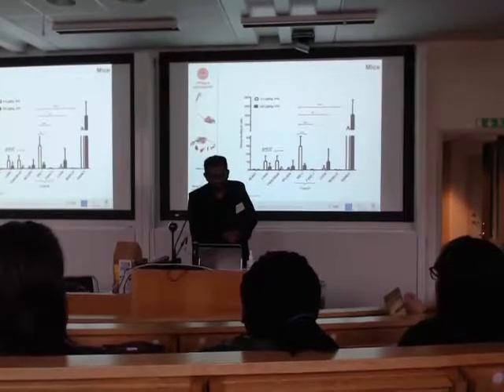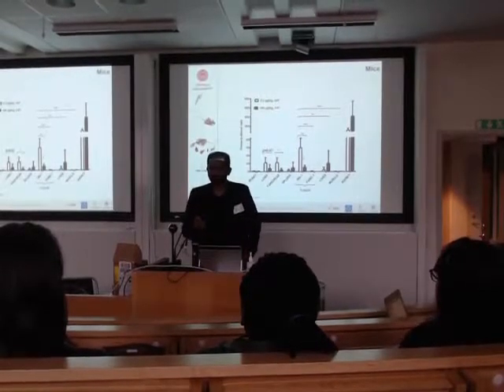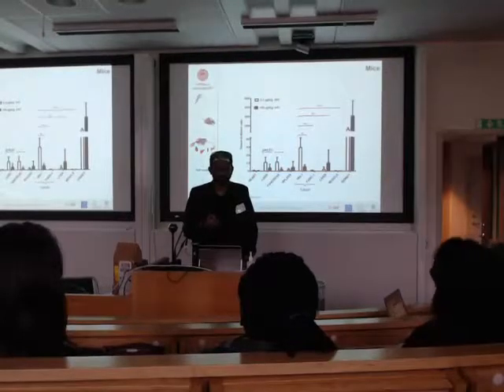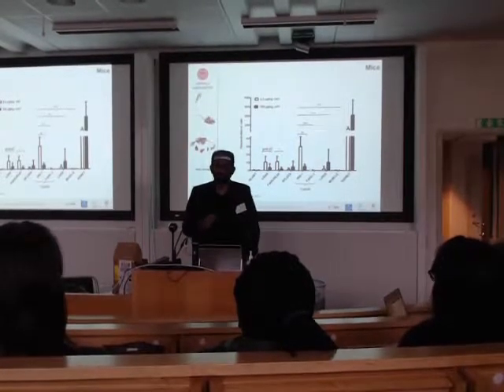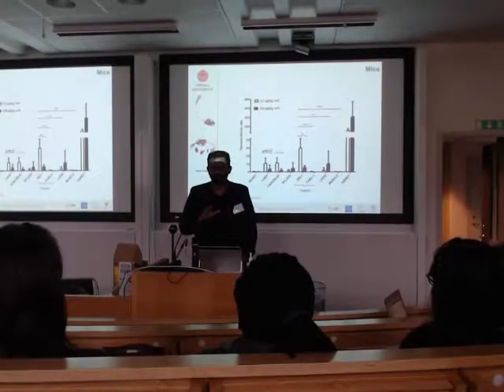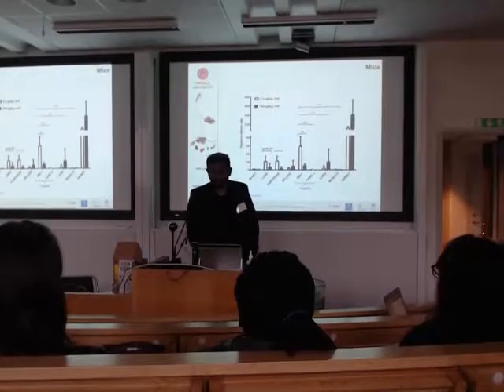So we are looking at the pancreas. Here you can see that we could significantly block uptake in the pancreas. Islets are in the pancreas. We also did a tumor model, the insulinoma tumor model, which expresses a lot of GLP-1 receptors as well. This is another way to confirm that your tracer is specifically binding to the receptor you're looking for. We also work with a negative tumor model: PANC1 cells, a cell line that does not express these receptors. If your tracer is specific to your receptor, you shouldn't see any uptake. And that's what you see. You don't see any uptake in the negative tissue model.